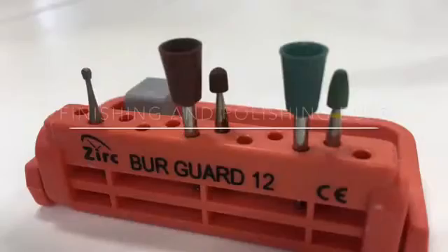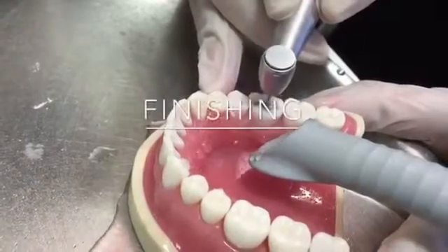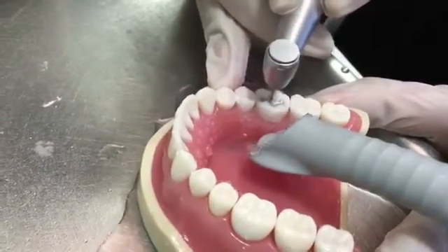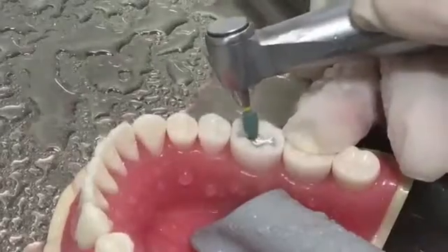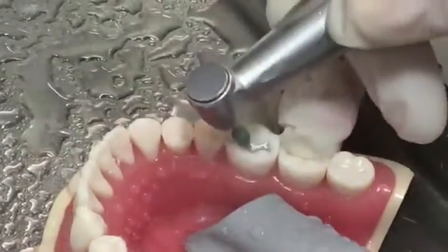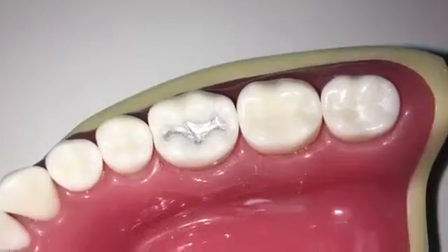Finishing and polishing of amalgam can be done, but after setting, which is 24 hours. So, for finishing, we're going to use finishing burrs following the normal occlusal anatomy. As for polishing, we're going to start off with brownies and then greenies. And the aim of finishing and polishing is to remove the voids on the surface of the restoration and therefore decrease plaque accumulation. And finally, there you have it, Class 1 amalgam restoration.